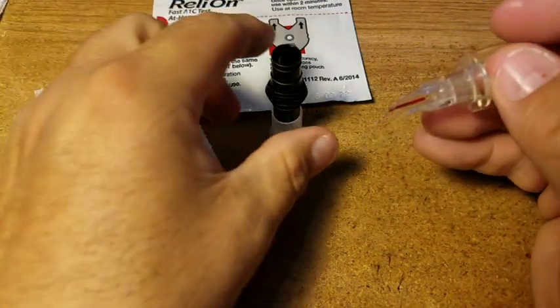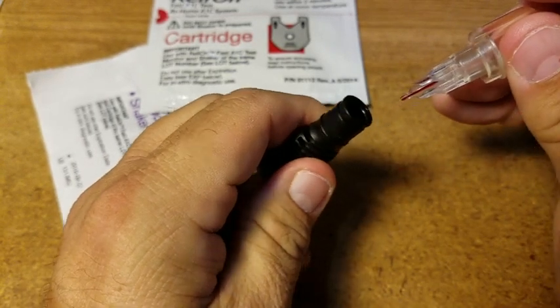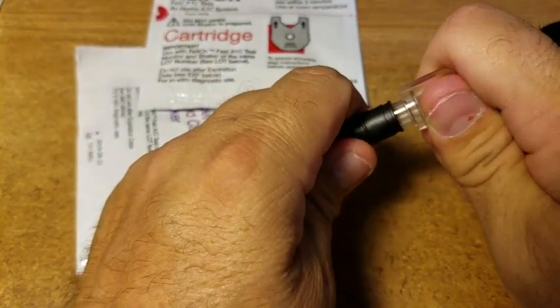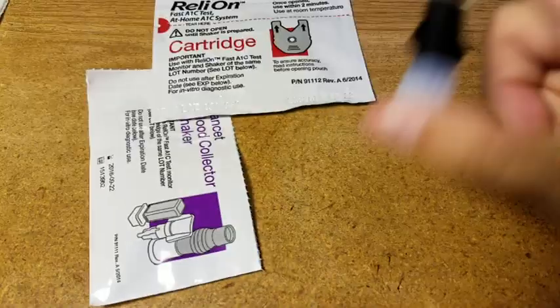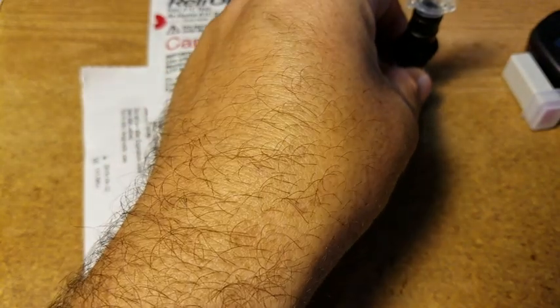Now I'm going to push in hard and pierce the seal down there, then shake it six to eight times. There, it's all the way in — so I'll shake it: one, two, three, four, five, six, seven, eight. And we'll let this set aside.